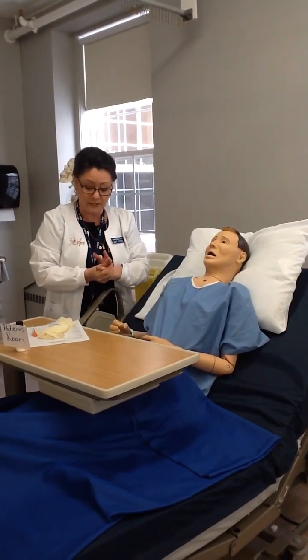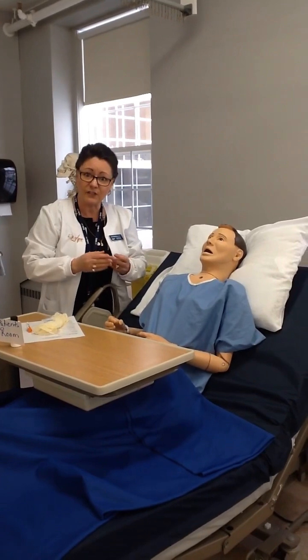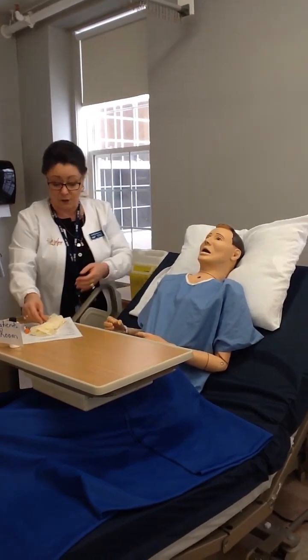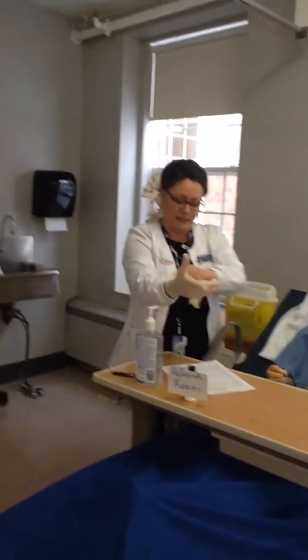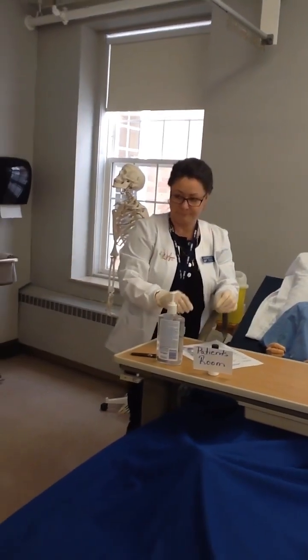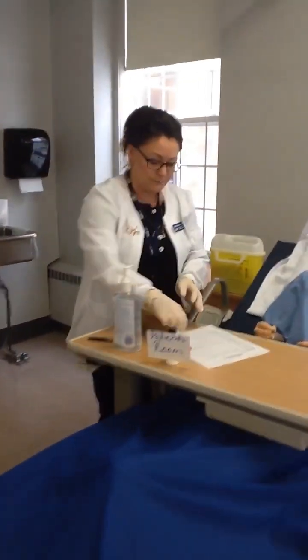So after I've made sure I have the right patient, then I can say, are you still okay to take this injection? And he will discuss it if need be, and he'll consent, and then we can go ahead and prepare that. So I'm going to go ahead and put my gloves on. I think I'm just going to grab my injectee pad, and we'll come over here and pretend we're in the patient's room.